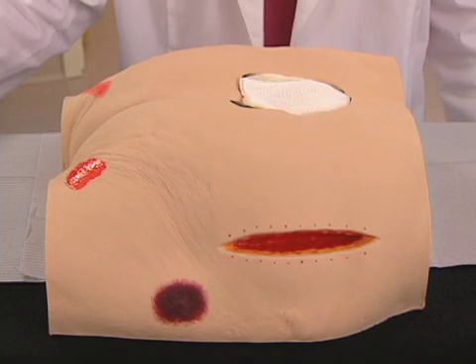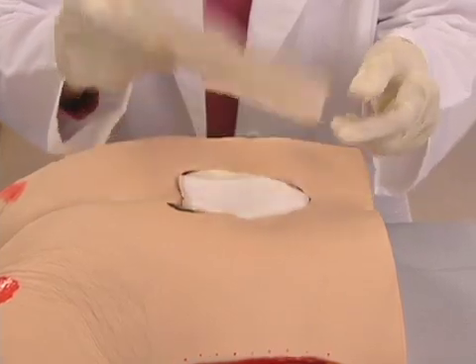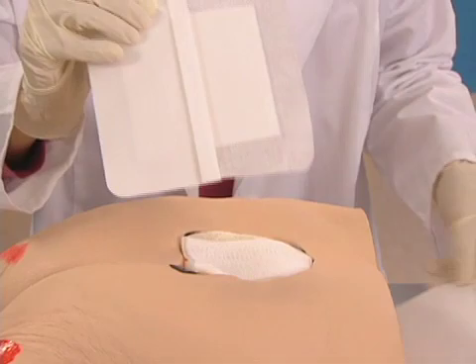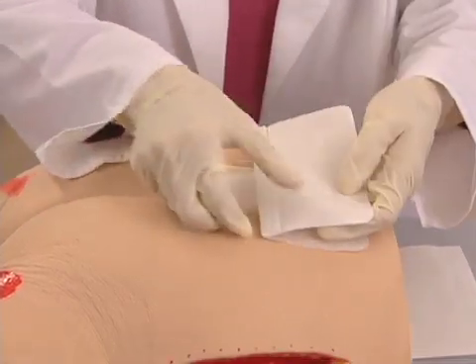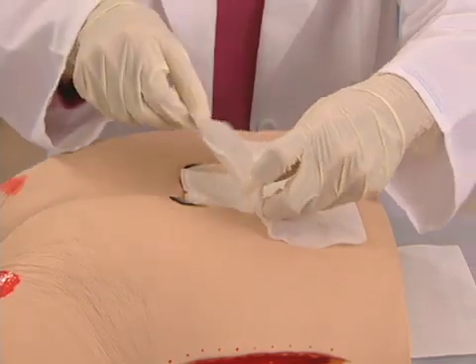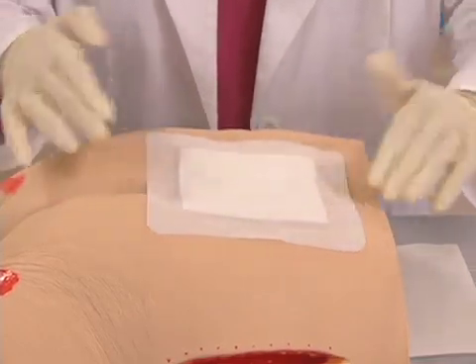To apply a typical composite dressing, first choose a dressing with a pad size slightly larger than the area of the wound. Open the dressing package by pulling the wrapper apart, and remove the release film from the dressing. Adhere the exposed adhesive side to one side of the wound. Finally, remove the second tab and adhere the rest of the dressing to the uncovered section of the wound. The composite dressing in this application is being used as a secondary dressing. Dressing should be changed when saturated or when recommended by the manufacturer.